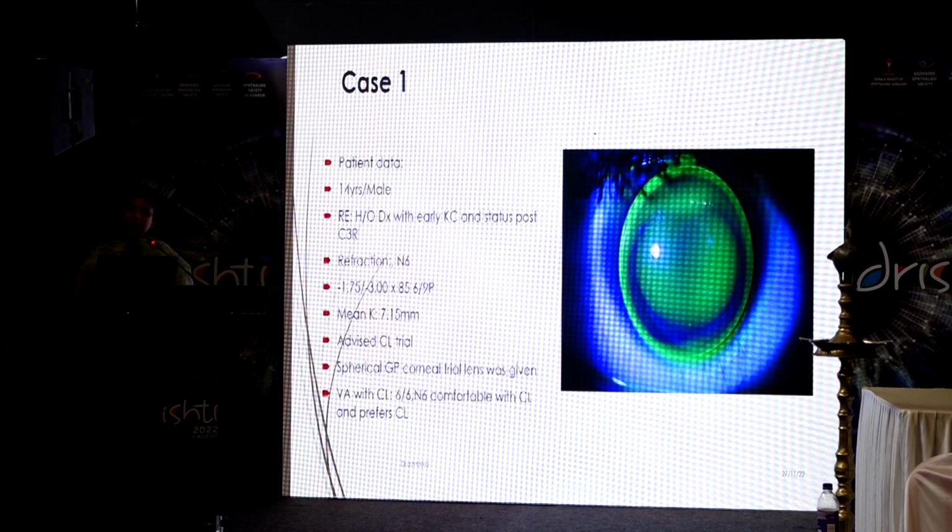So even for an early case of keratoconus, I see practitioners jumping into fitting a scleral lens, which is not at all required. Every lens has its own pros and cons, and remember, these are compromised corneas.